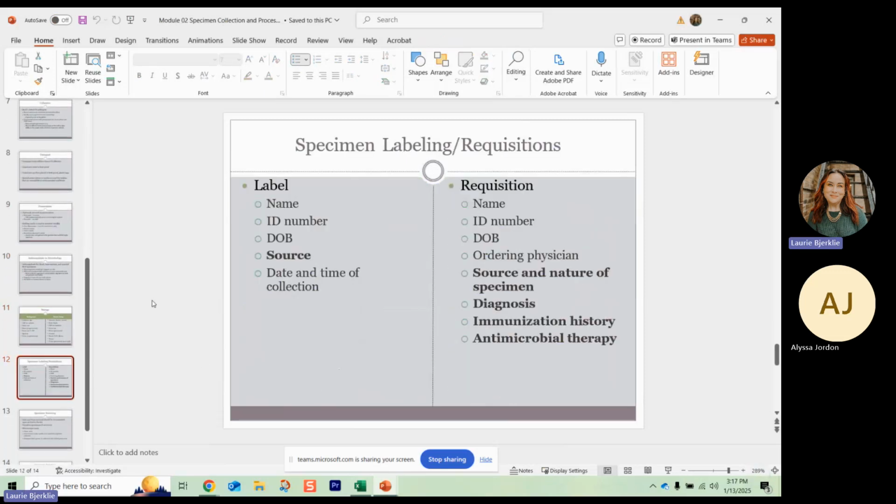And then labeling. The biggest thing with labeling is if you learned phlebotomy, you learned about the importance of labeling, identification, right? Normally you have always the patient name, the patient's date of birth, the time, the date collected. But for micro, you have to have the source. If you send me a swab and do not tell me what it's on, it means little to me because your ear pathogens, the bacteria that are known to cause like ear infections versus what might cause a wound infection versus a genital tract swab. Genital tract swab is gonna be far different than an ear swab.